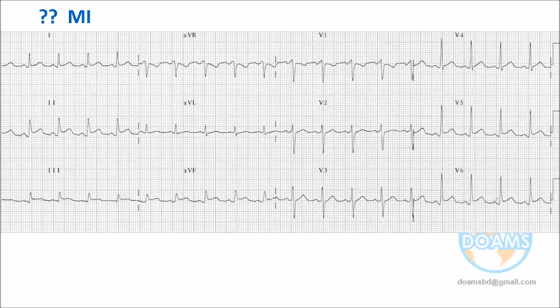Can you follow, Dr. Sabine? Yes, doctor. Sorry, it may not be a straight one. If you like the straight one, this is the baseline, the isoelectric line. So can you say that this is ST elevation? No, doctor. Again, come to V5. This is the P, this is the TP segment. It is obliquely placed in the tracing.